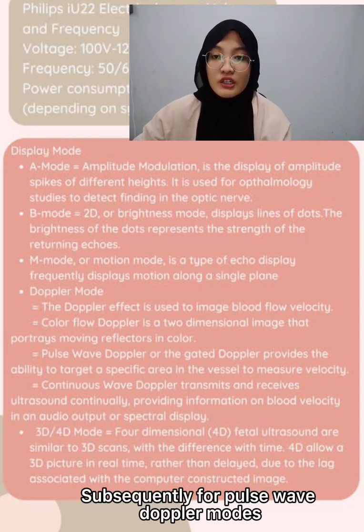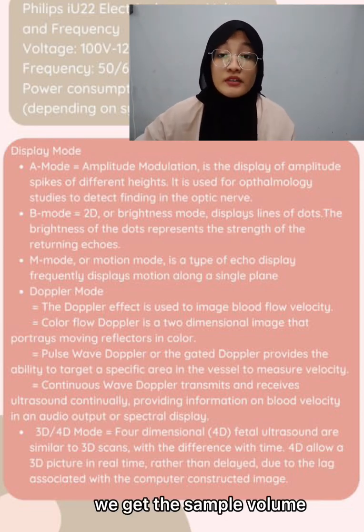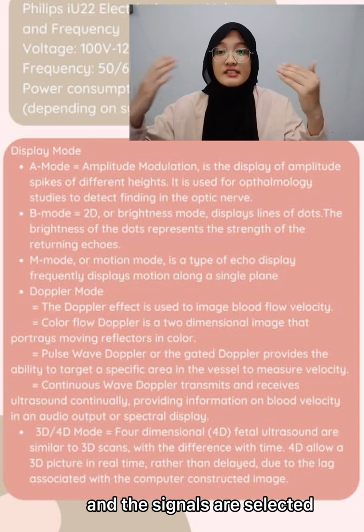Subsequently, for pulse wave Doppler mode, we get the sample volume and the signals are selected.